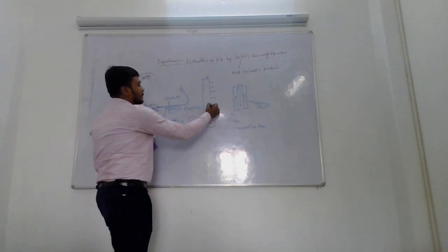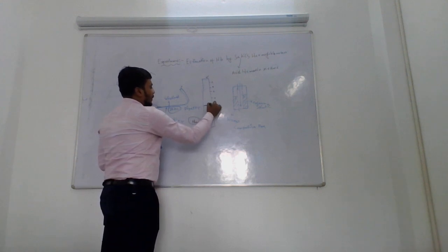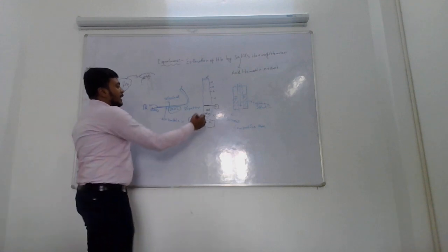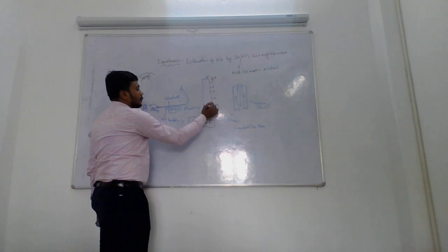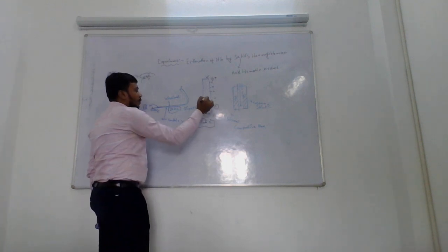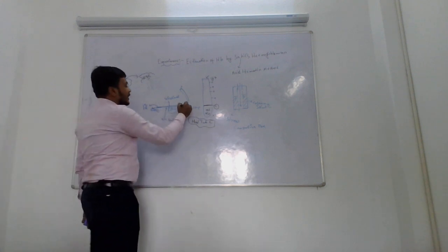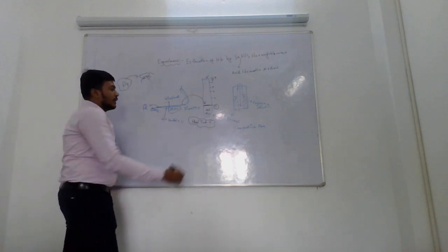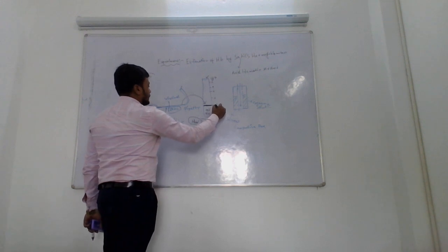Now we have to take N/10 HCl. We fill the HCl up to the 2 g percentage mark. Then we take 20 microliter of sample and pour it into this HCl. Now the volume will go up to the 2 marking.